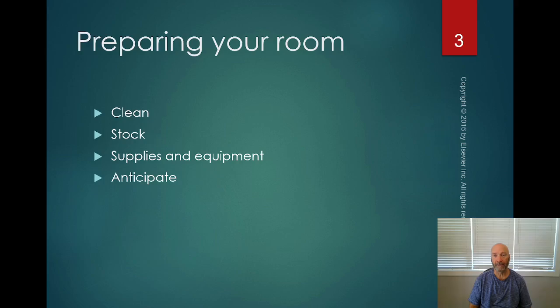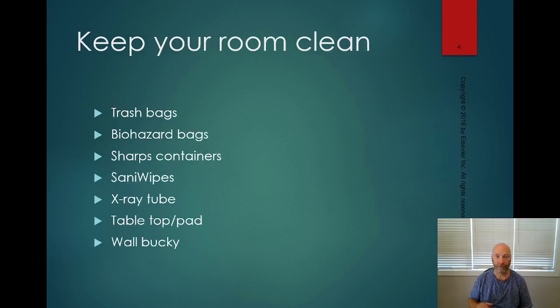So if you happen to see something that's a little bit off, an exam type that you don't normally do, it's not completely weird. If you've got equipment for it, then go ahead and have that on hand so that you don't have to scramble and go look for it later on. So keep your room clean.